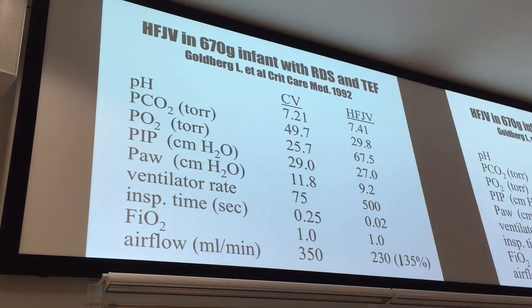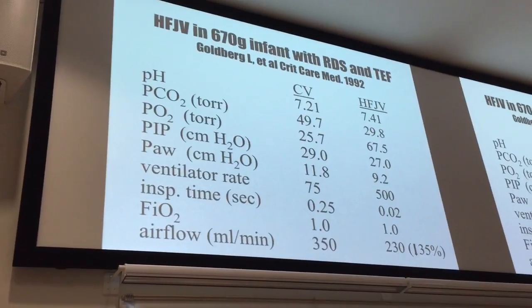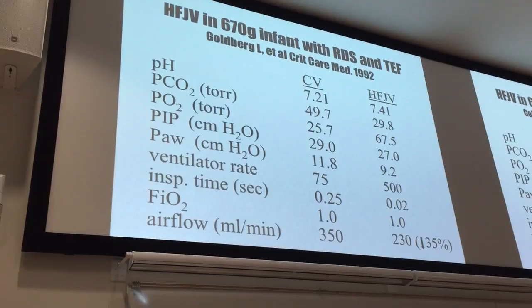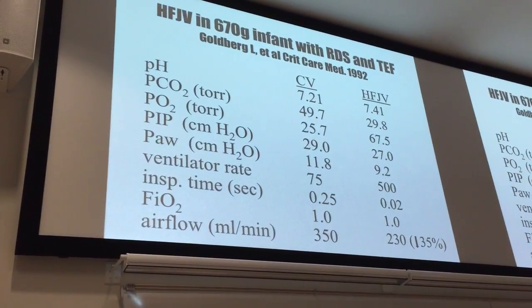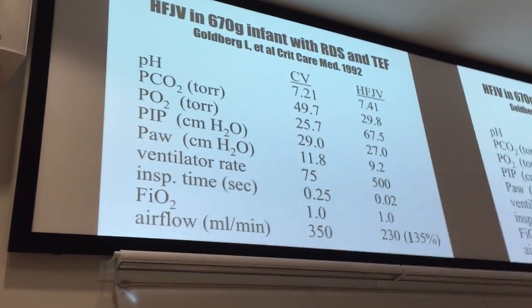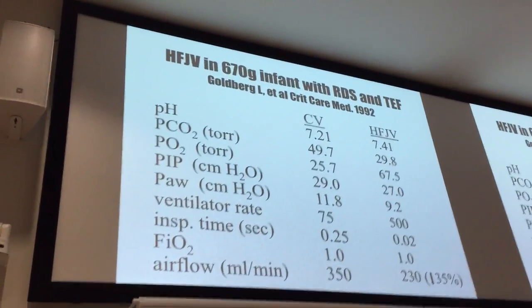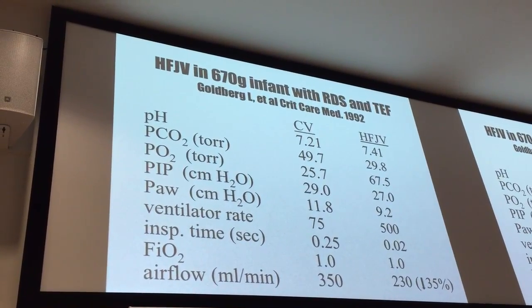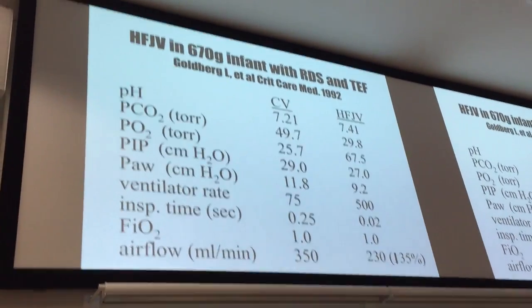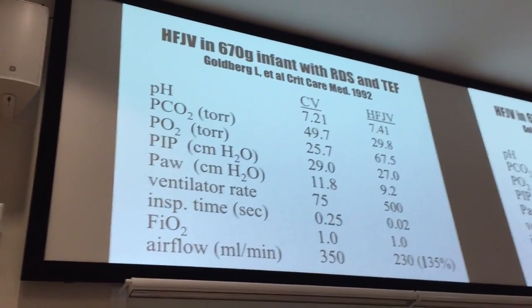We had some fun with a scenario of a very immature baby back in the early 1990s. It was a 25-weeker, it was a large TE fistula, and not very good gas exchange, and the belly out to here because it was a big fistula. So deteriorating ventilation. So great, call the surgeon. Surgeon comes in, puts in a decompression gastrostomy. Everybody's happy except the baby, who is now losing half each tidal volume out the gastrostomy tube. So what to do? Well, we need the jet.